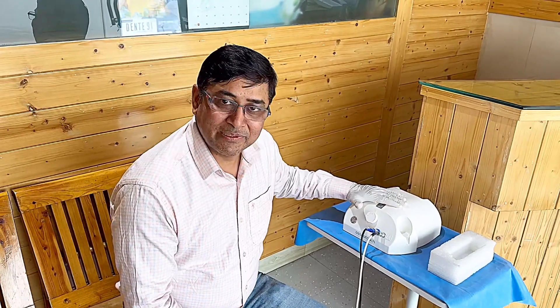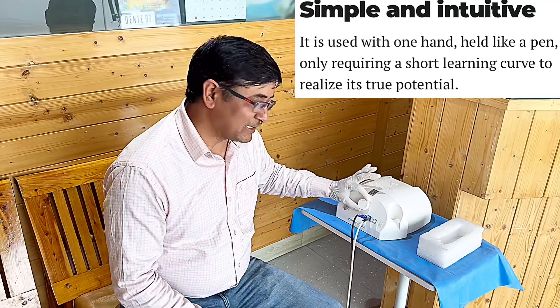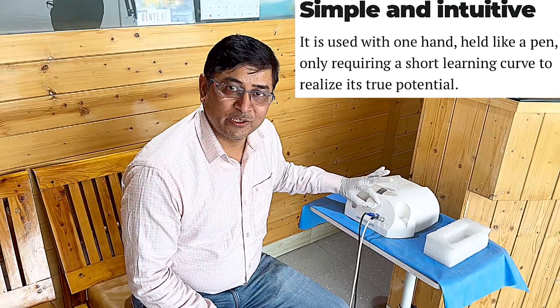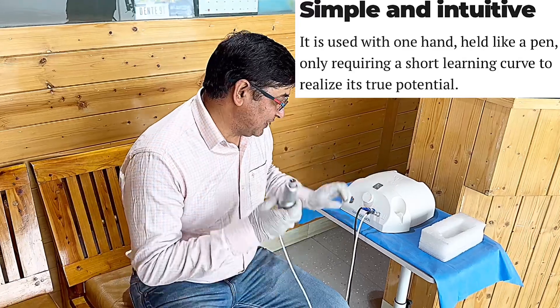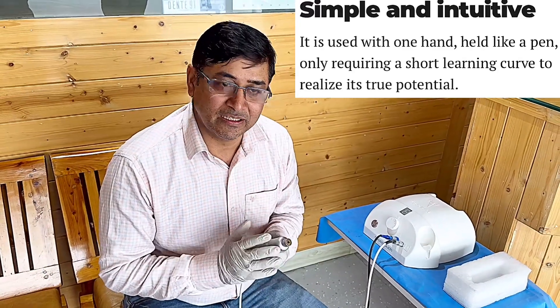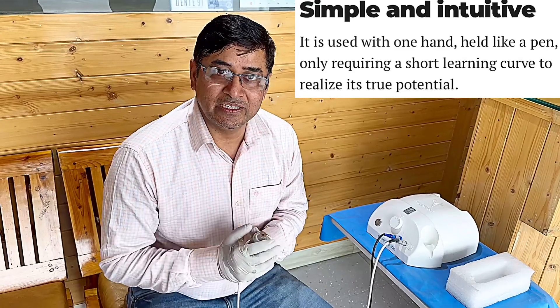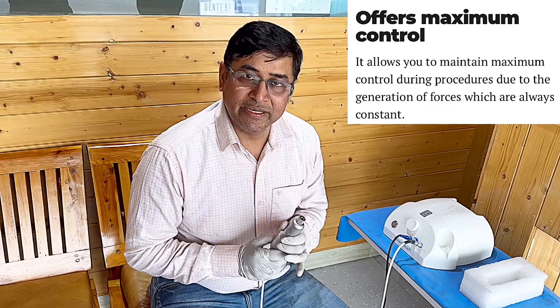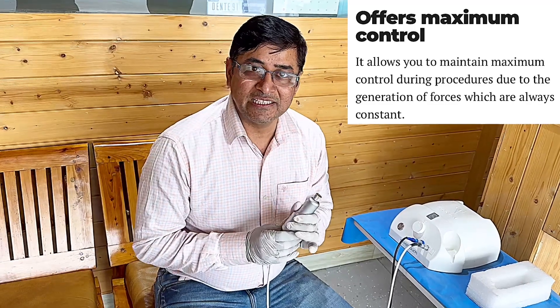I will tell you about the machine — it has a power setting button which allows us to reduce the power based on our needs. This is a magnetic mallet which uses magnetic force to drive the power to our tips during procedures. It is very precise.